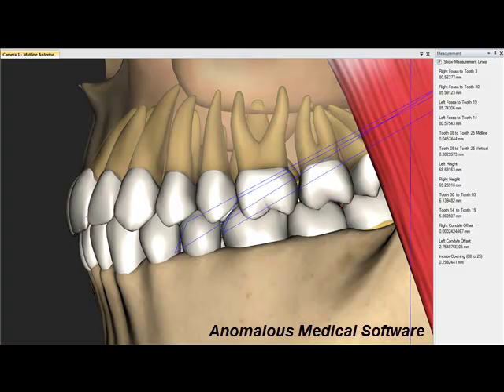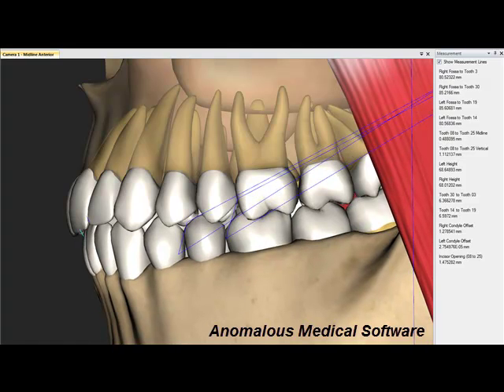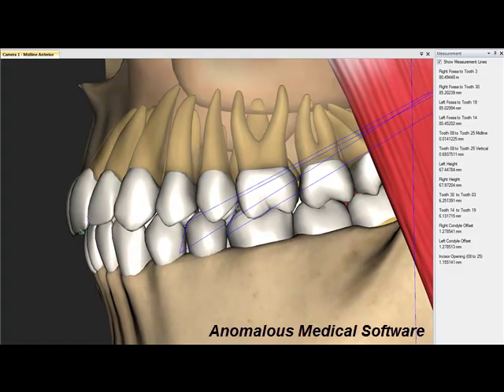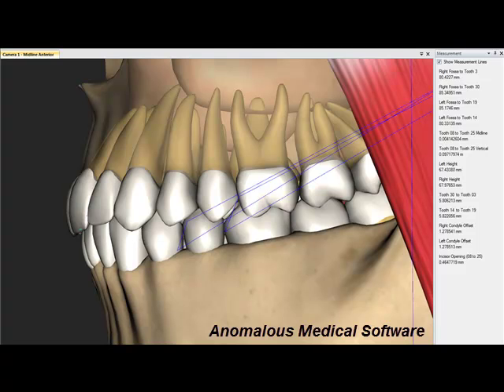And as I dislocate the right temporomandibular joint disc, it's going up to 1.1 millimeters, and distorting the left temporomandibular joint disc, that number is going up to almost 2 millimeters. And then when I go back to the adapted state, I'm bringing it back down to basically 0.1 millimeters. So I'm somewhat over adapted.